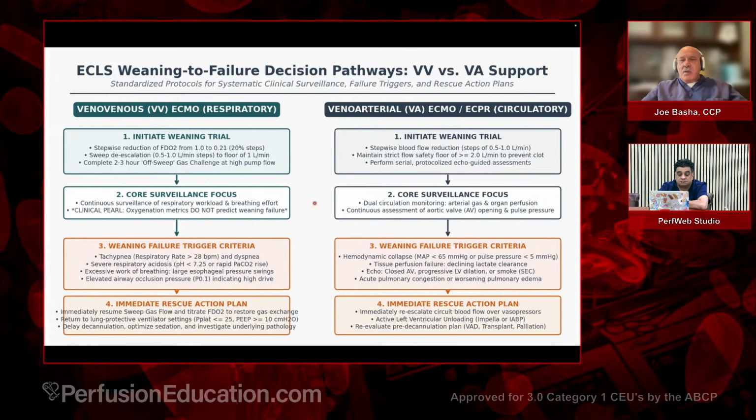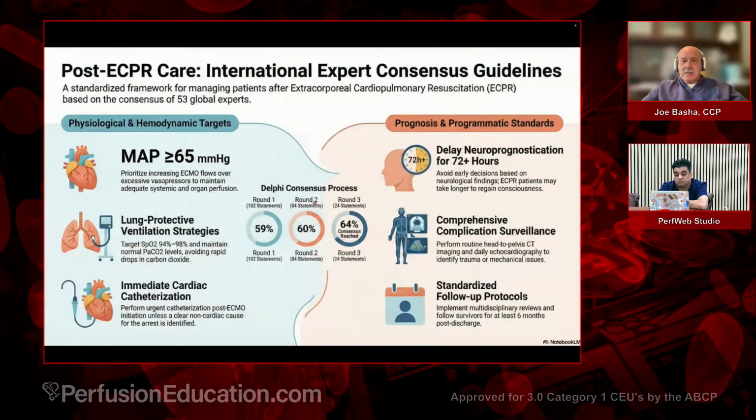And then we'll move into the Delphi, which is here post-ECPR care, and this is an expert consensus guideline. They went through 3 rounds, and round 1 was 102 statements, reduced down to 84 statements, reduced down to 24 statements, with 64% consensus reached. And this is for ECPR, so this is VA, right?